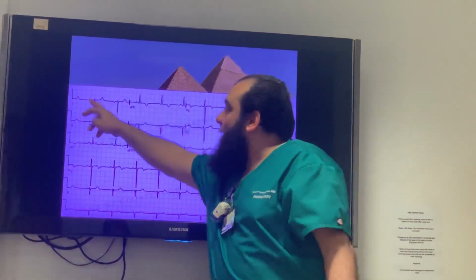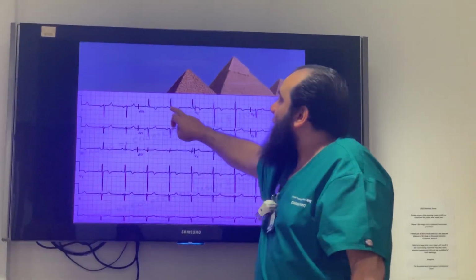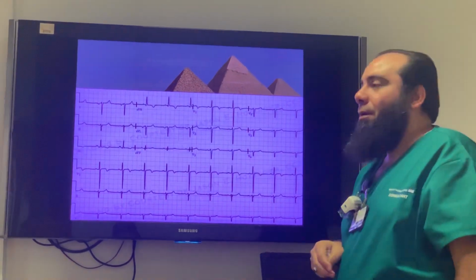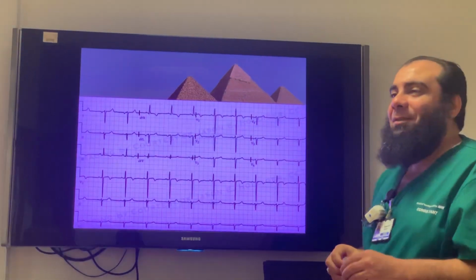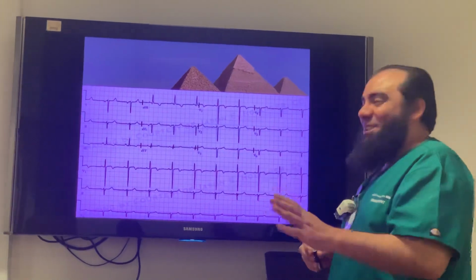And if we have seen a negative P wave here, the deflection of the complex also is different here. aVR is positive, with the P wave positive in aVR. What does it mean? Wrong leads. What more? Dextrocardia. How can we differentiate? Looking at the patient. Clinically, yes. I appreciate that.